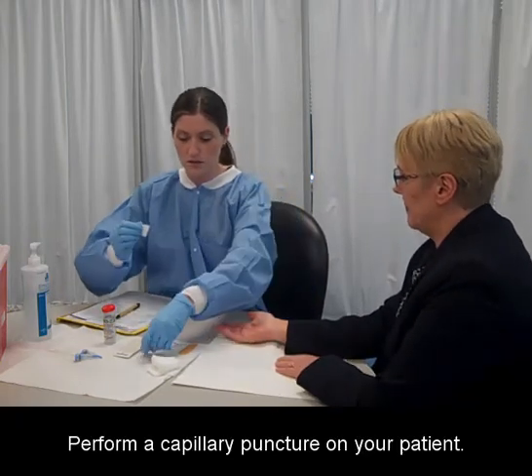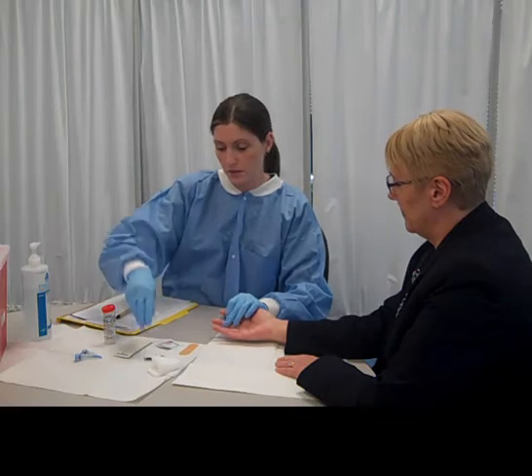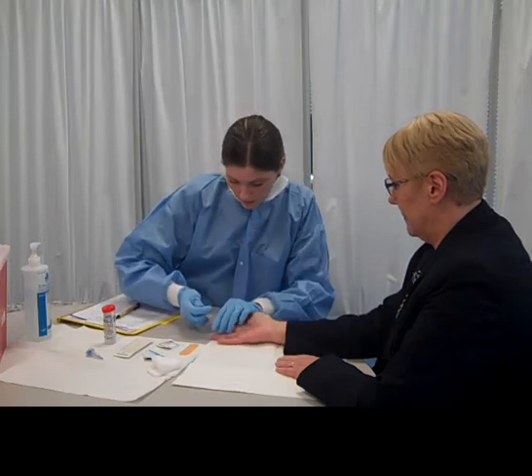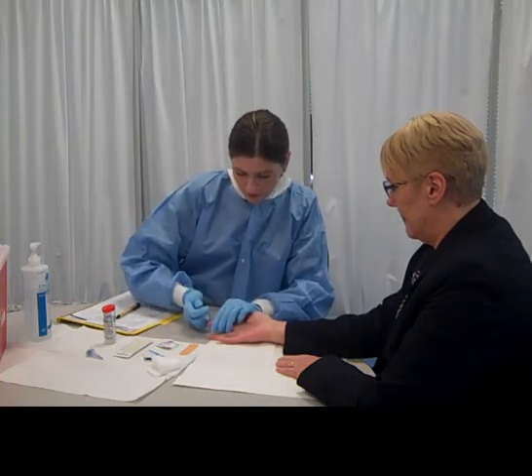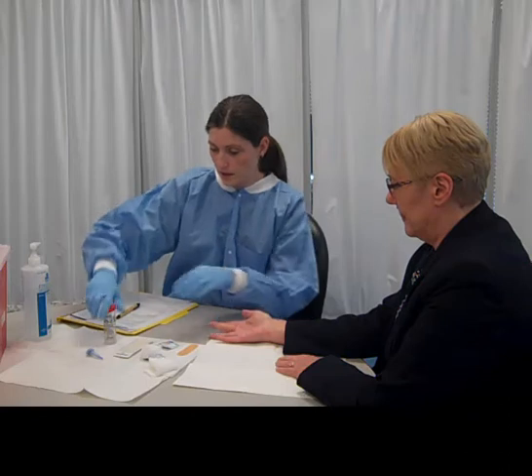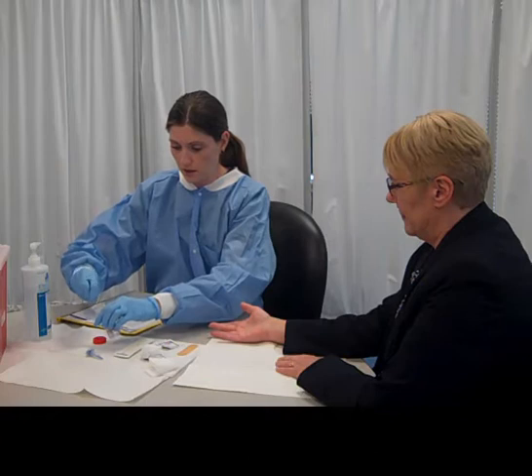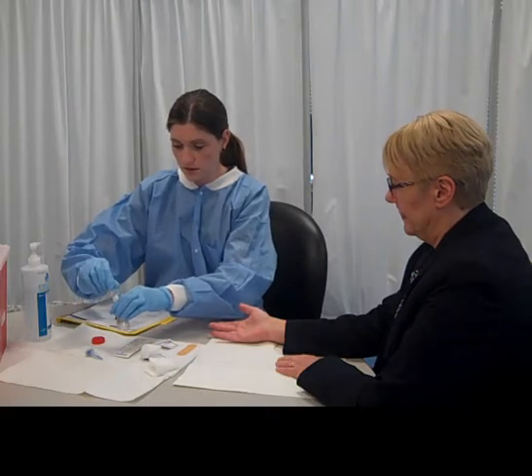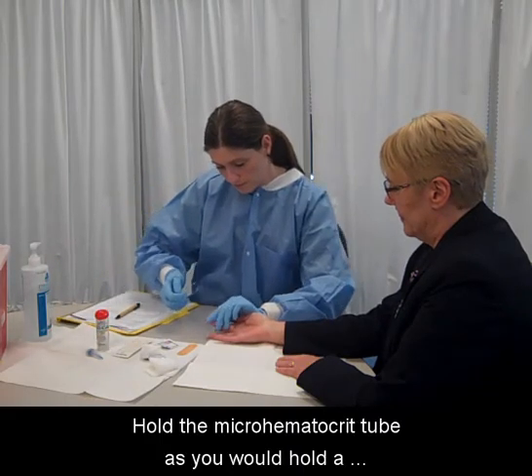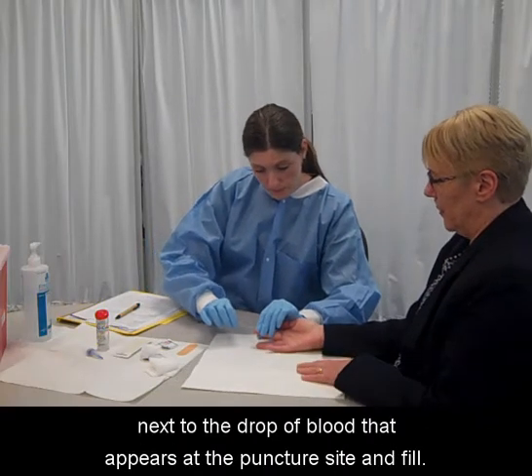Perform a capillary puncture on your patient. Wipe away the first drop of blood with a gauze square. Gather the micro hematocrit tubes out of the container. Hold the micro hematocrit tube as you would hold a pencil or pen, horizontally with the opening next to the drop of blood that appears at the puncture site, and fill.